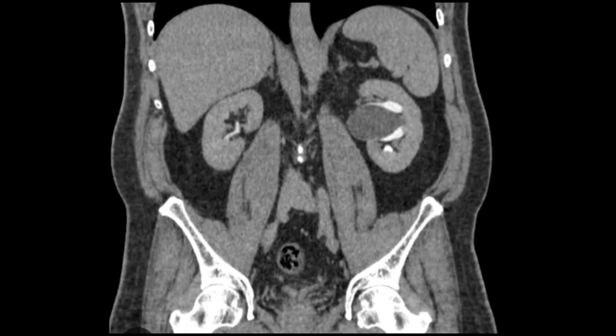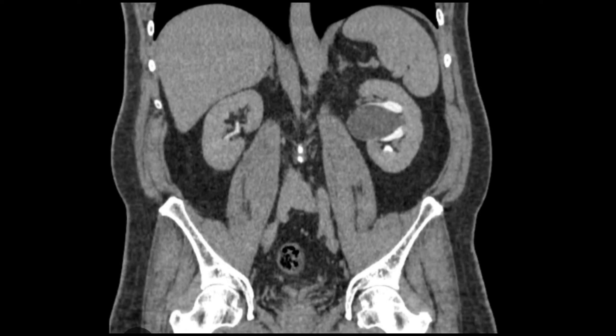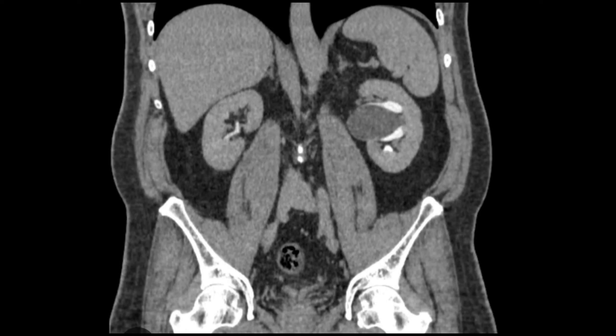This is another scan — a coronal scan — and on it you can see that the left kidney has a parapelvic renal cyst. This usually happens bilaterally, but in this case only the left kidney is involved. Regarding renal scintigraphy in cystic conditions of the kidneys, it does not have much appreciable value, so renal scintigraphy is not very useful for renal cysts.